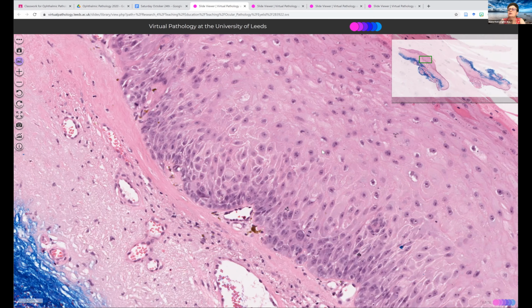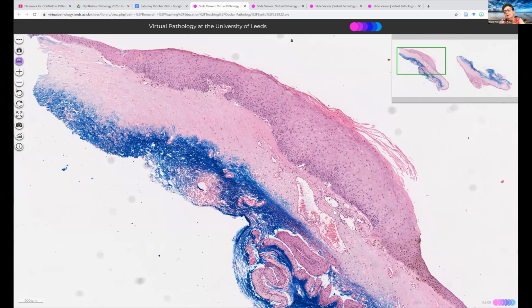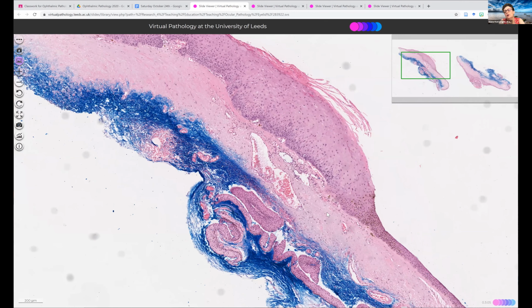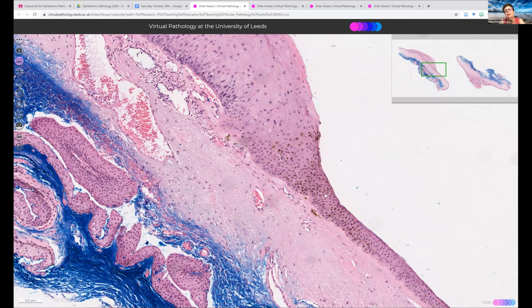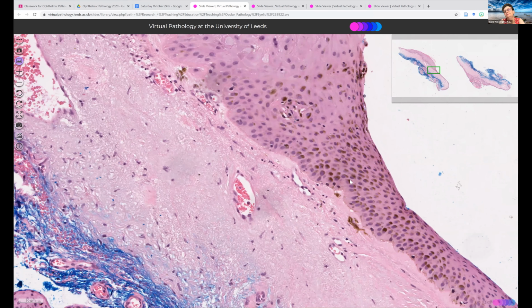Another question, what about the melanin there on the right of the top lesion? The right of the lesion that you're in at the moment. There is a little bit of melanin there. You guys will know why conj is pigmented. Do you think this could be physiological pigmentation?